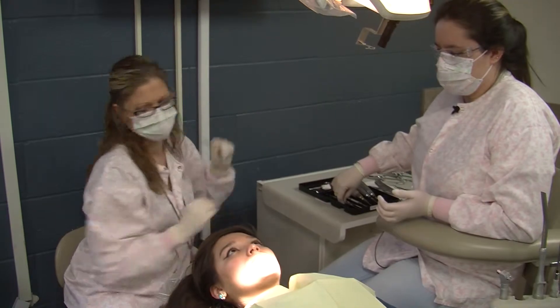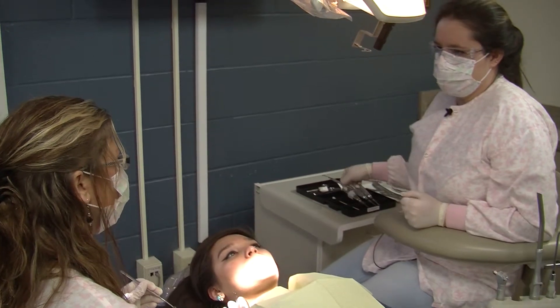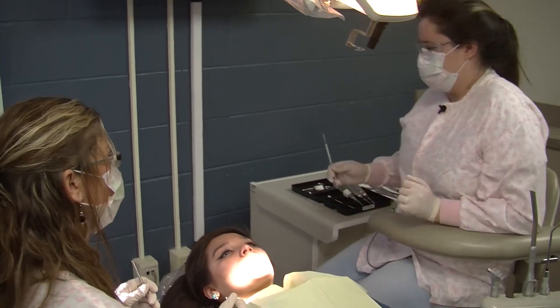Then we're going to grab the explorer again to check and see if the gums around our tooth are numb. And then we're going to get the periosteal elevator to break away the gums around our teeth.